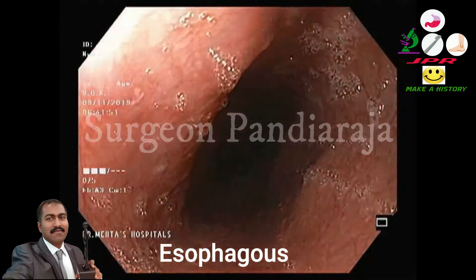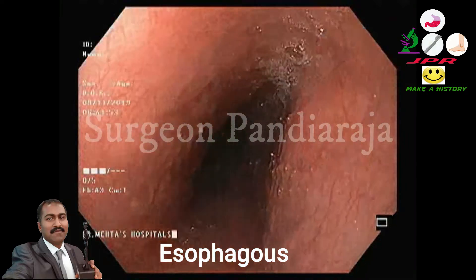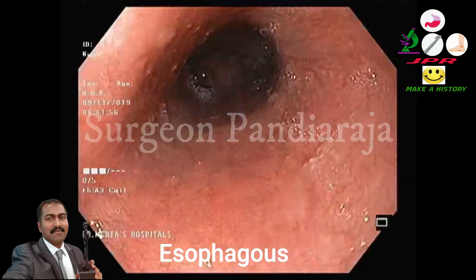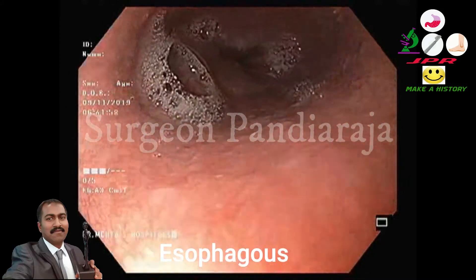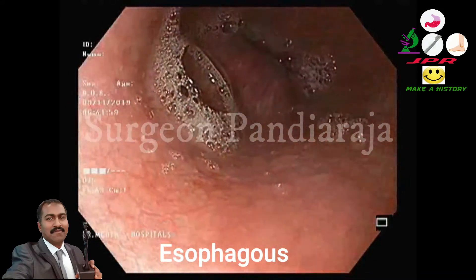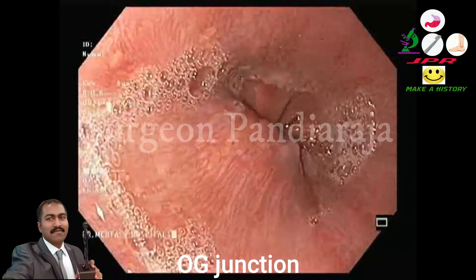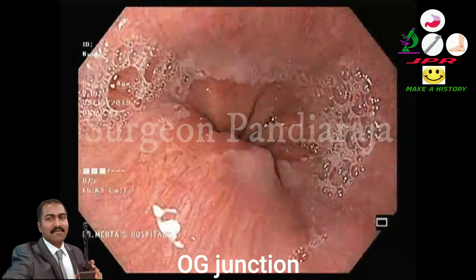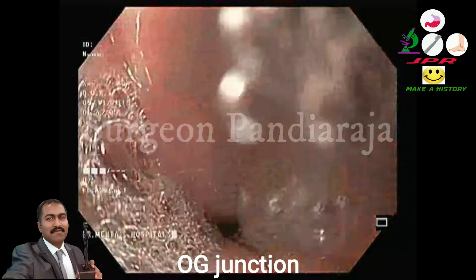Now the scope is inside the esophagus. Further advancement of the scope leads to identification of the gastroesophageal junction.